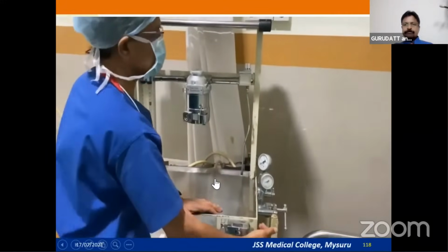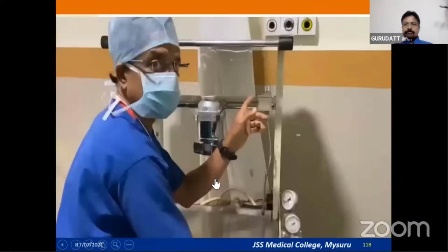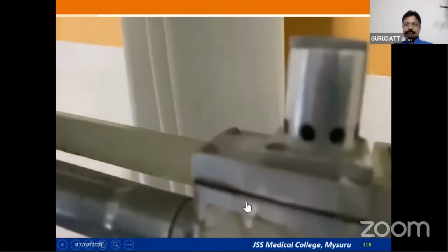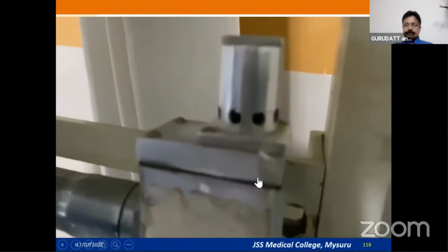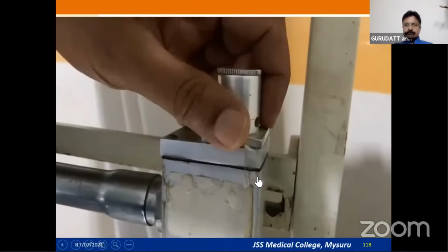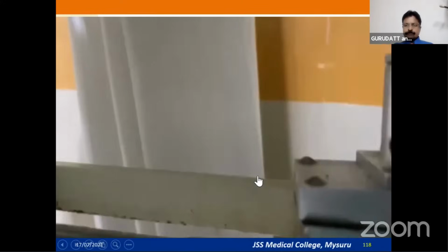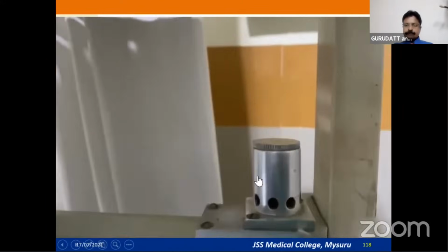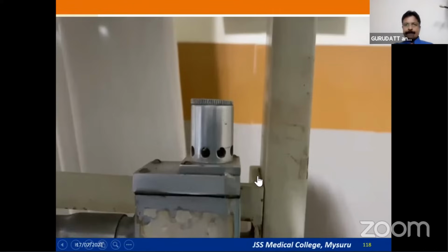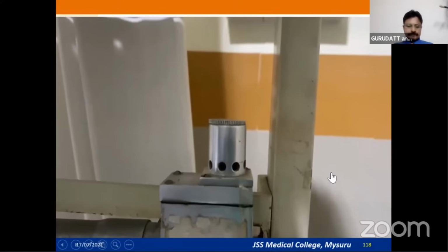You can hear a hissing noise. So what I have done is I have blocked this. If you can come close by, can you record that hissing noise? See, I have just closed. You can hear the hissing noise here. Now it is better heard because the pressure has developed.